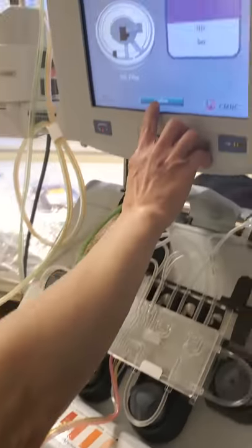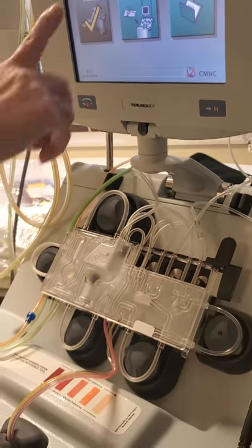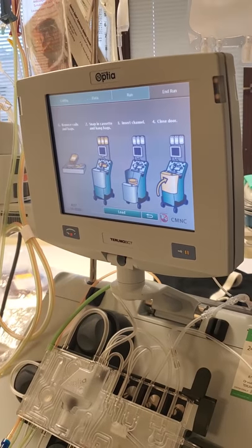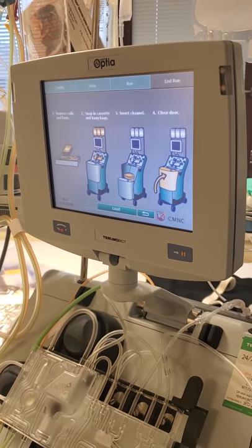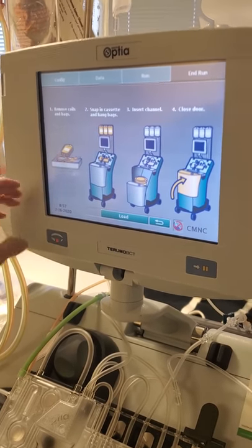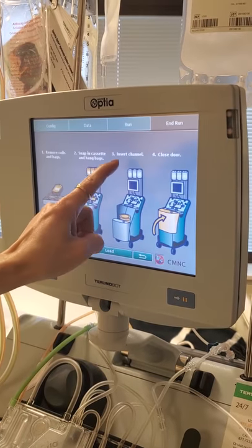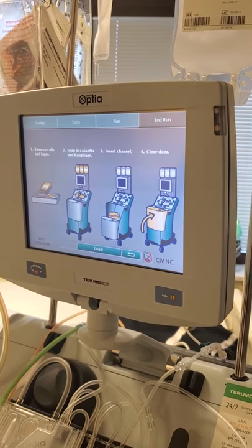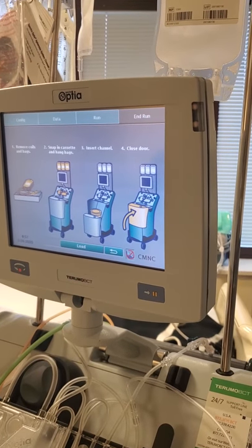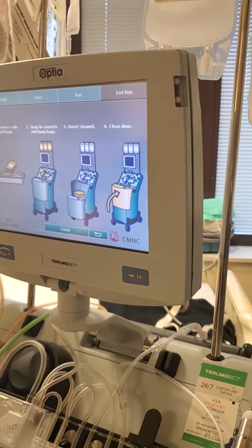Light channel. The next box says to prepare the tubing set. Now you want to read these out loud and make sure you've done all of them, in order: remove coil and bag — I did. Snap in the cassette and hang bag — I did. Insert channel — I did. And the door is closed. As you push load, you want to keep an eye on all that tubing that's sitting on the shoulder so it doesn't get trapped behind the cassette tray.